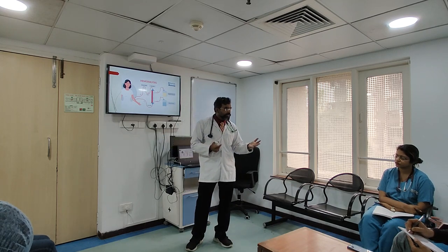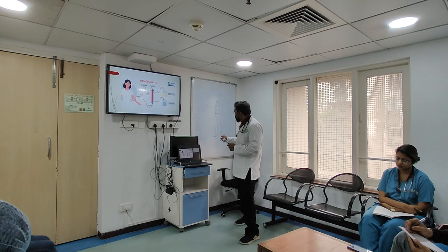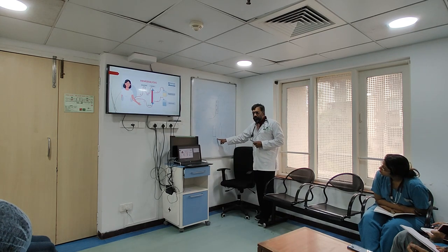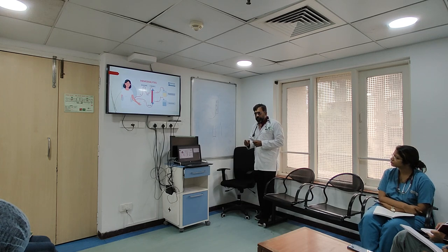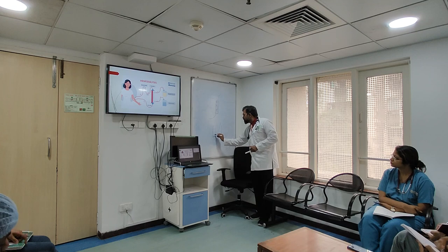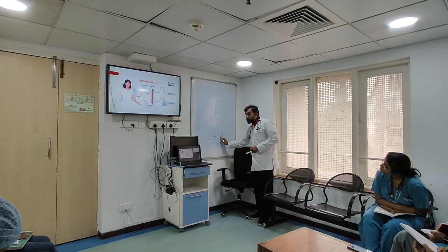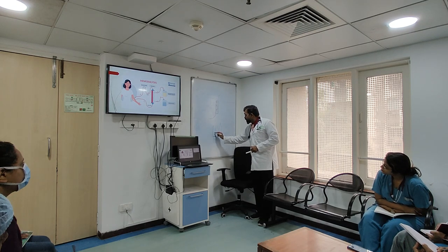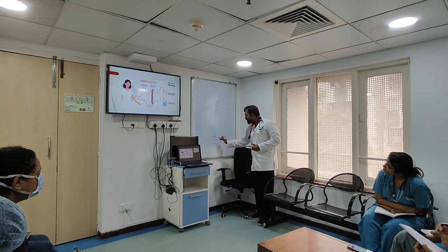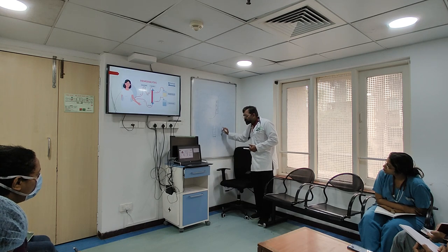Right? Clear on this? So now, my diagram says that there is a semipermeable membrane here, and there is high potassium here. So when I'm going ahead, what is going to happen to this potassium? It is going to reduce, because water is coming from here which does not have anything. The gradient is going to be maintained all the time because there is fresh coming from here. You understand what I'm saying? There's fresh coming from here.